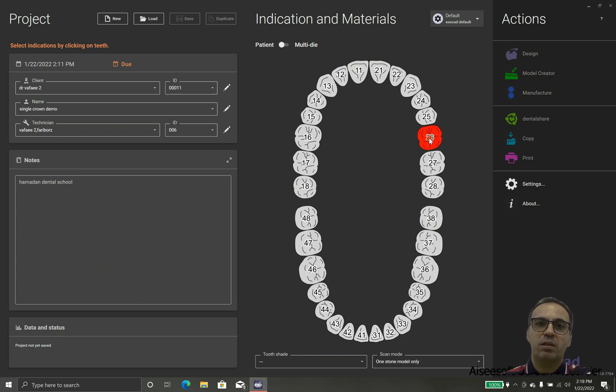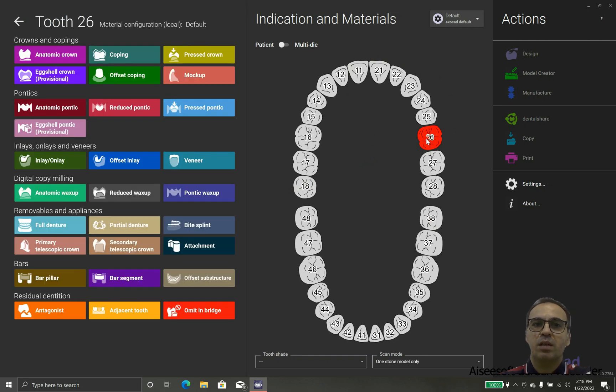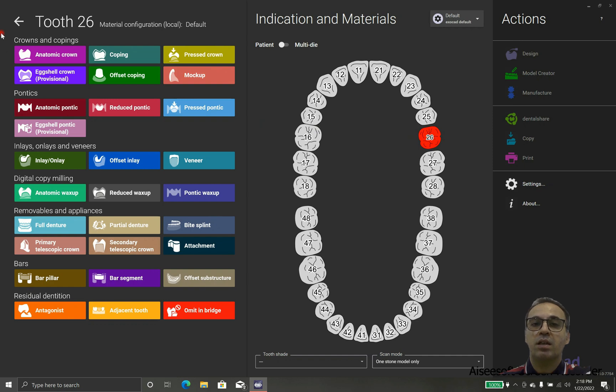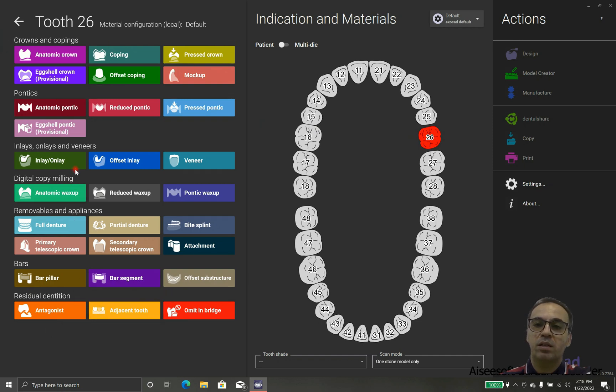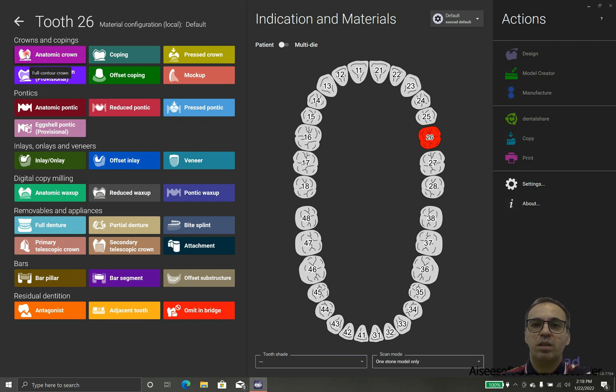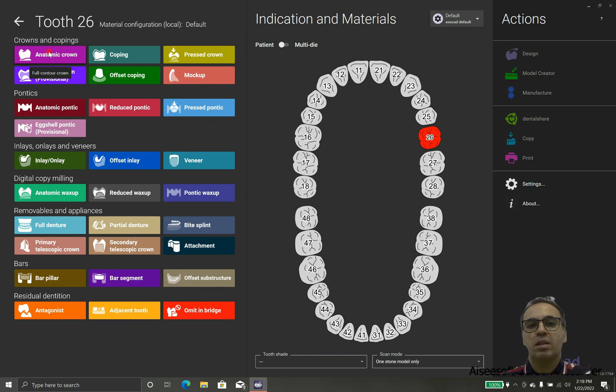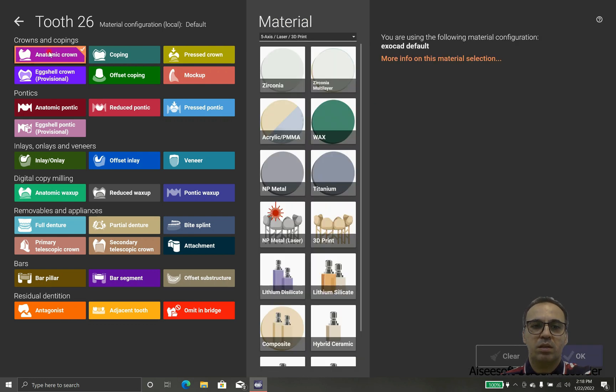Right now the save is not enabled because we didn't tell the software what we are going to do. We are going to design this tooth 26 with an anatomic crown.